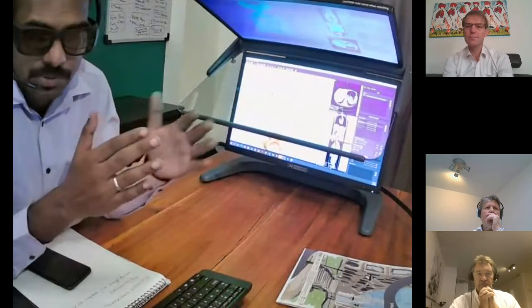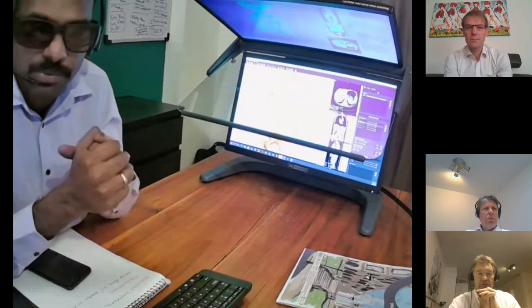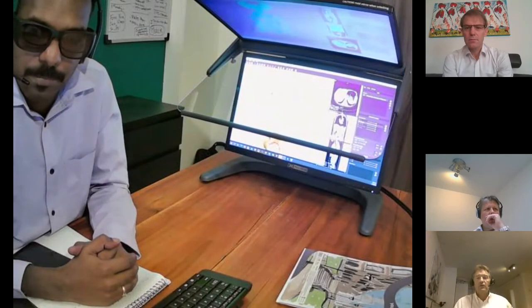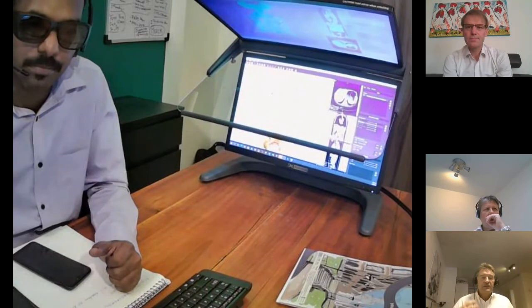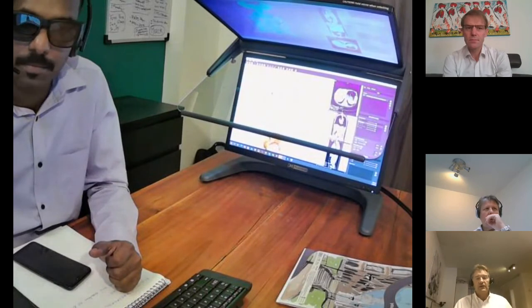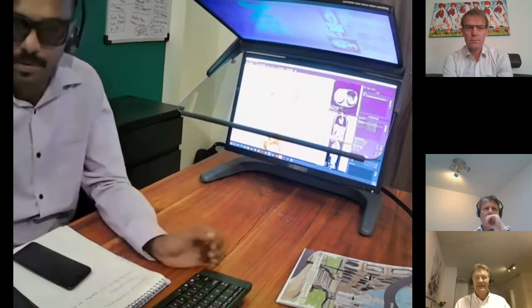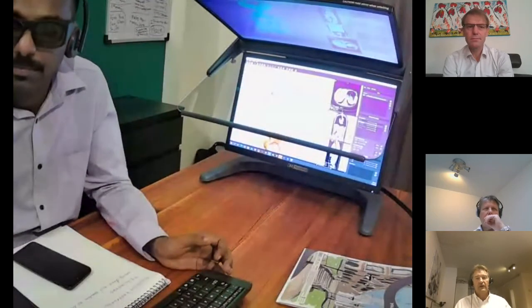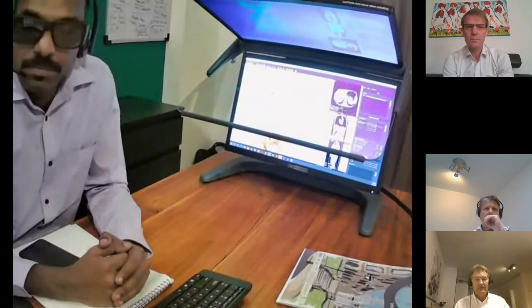For instance, if you have a small space, you can actually take up the 22-inch with the Vesalius software in it. Right. And for us as a company, we have a long working relationship with Schneider Digital. For us, it's a very good thing. We used to make our own 3D workstations in the past. Thank God that Schneider Digital exists, because it's their headache now. But it's an additional means for a doctor of showing your 3D data, showing your DICOM data.